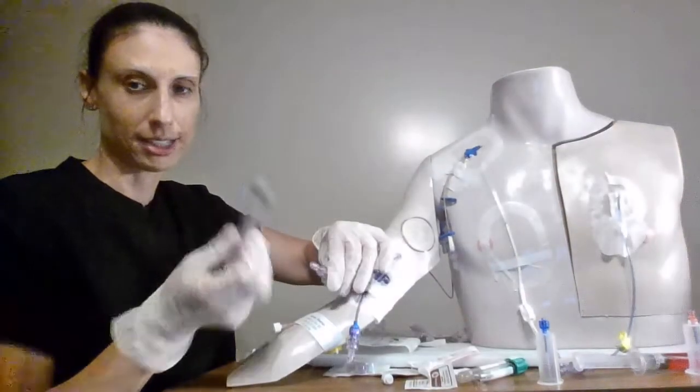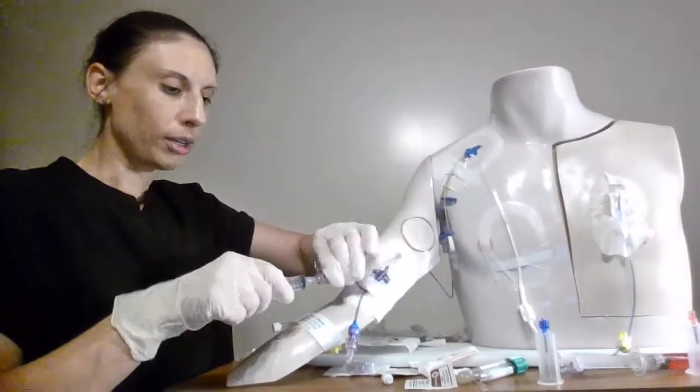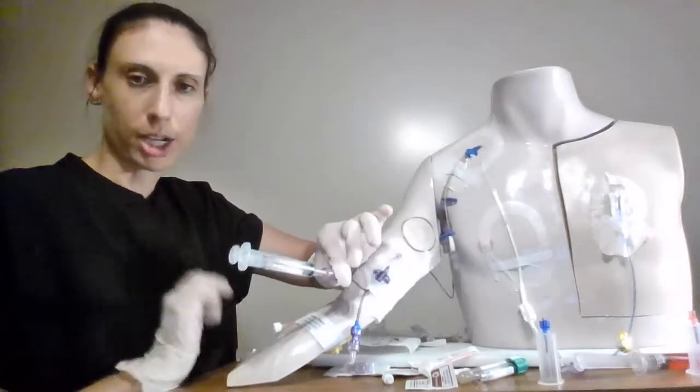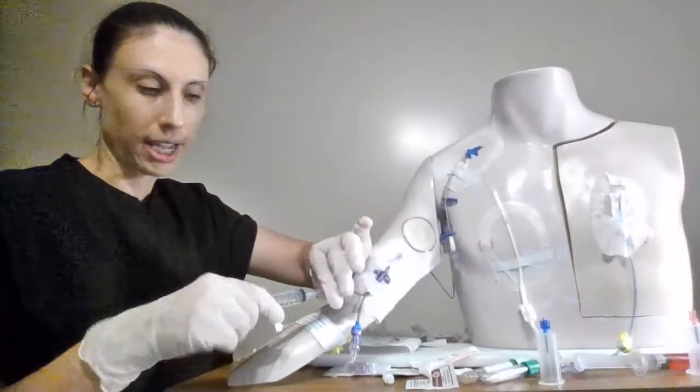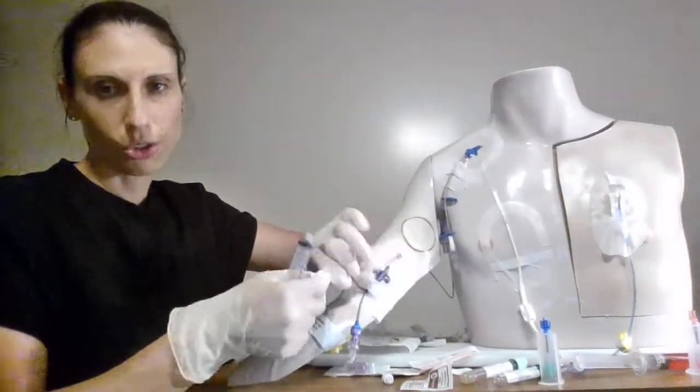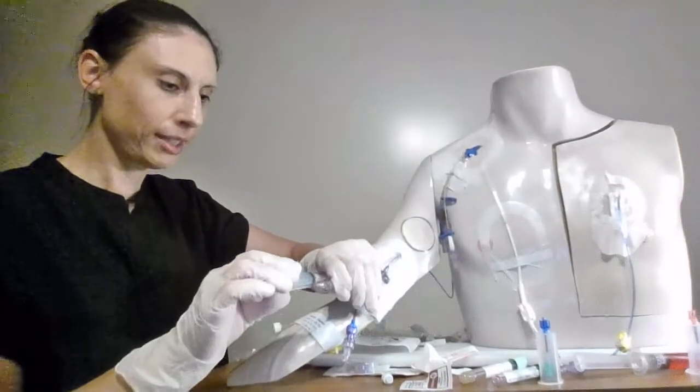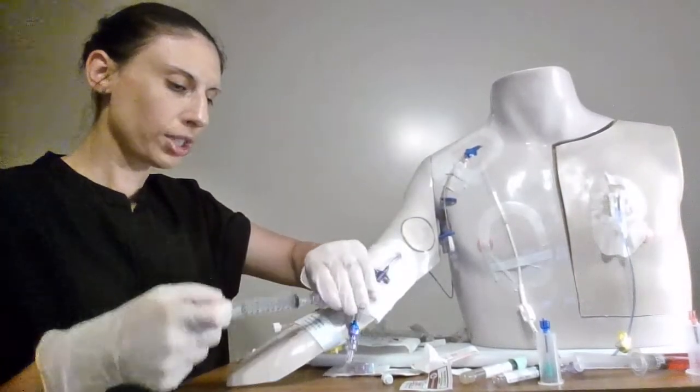Now if I haven't dropped my lumen at all or my cap I can just attach my syringe right to that the end. If I put it down for any reason make sure you re-swab. 30 seconds dry for 15. So we're going to attach that syringe onto there.